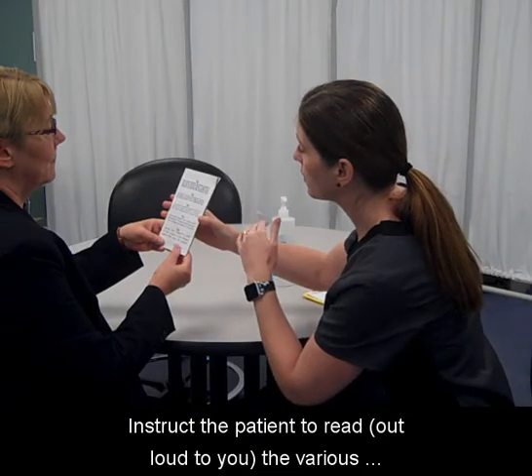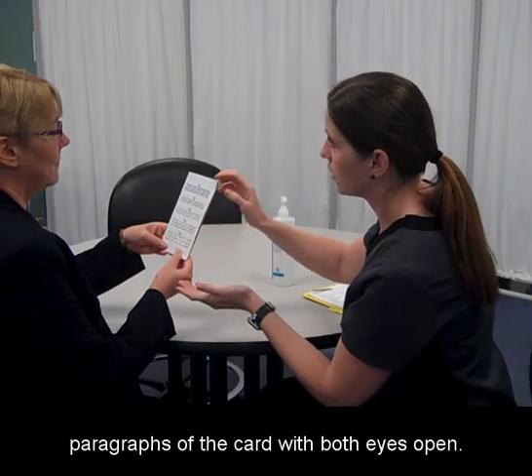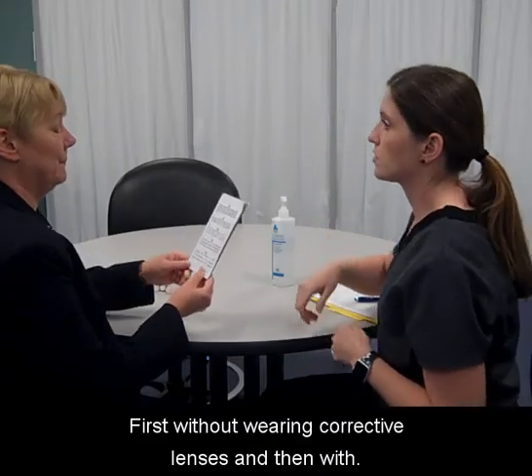Instruct the patient to read out loud to you the various paragraphs of the card with both eyes open, first without wearing corrective lenses, and then with.